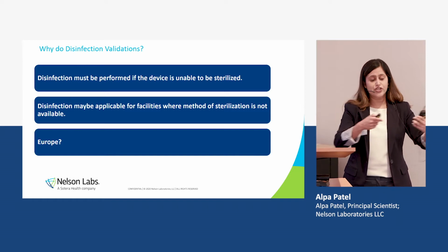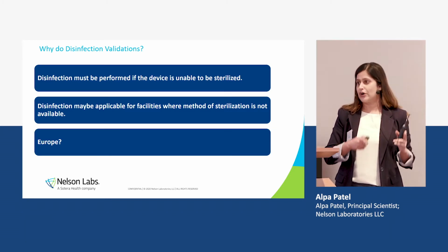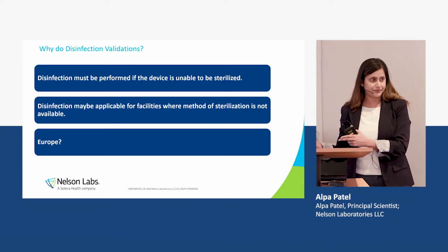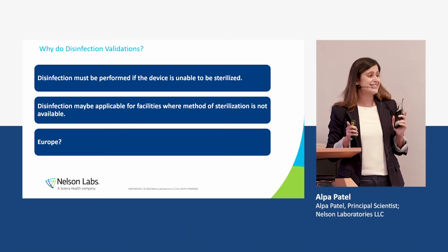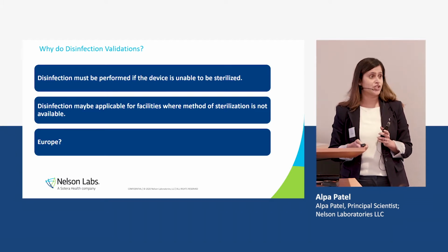So when they're doing that, they want to make sure it's safe for the users to handle the product and get it in packaging for sterilization. Thermal disinfection is also done if that is your end point for validation. And there's no sterilization needed at the end.